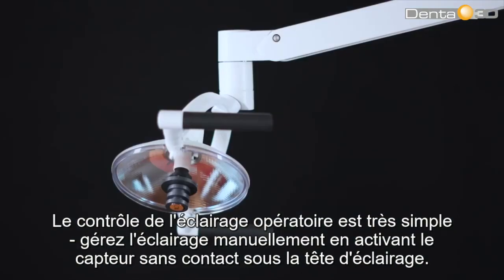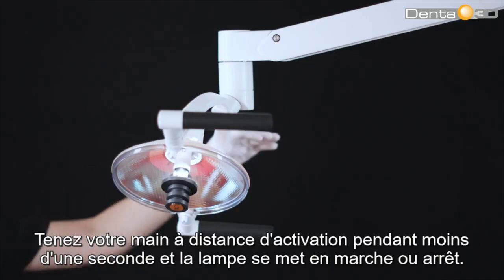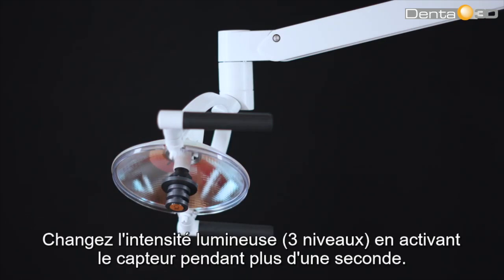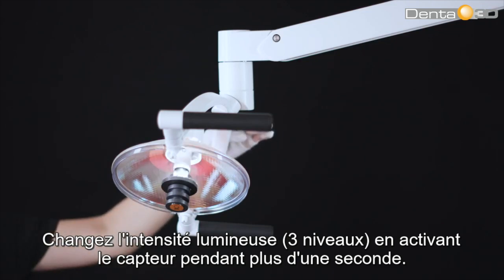Controlling the operating light is very easy. Manage the light manually by activating the no-touch sensor under the light head. Hold your hand within activation distance for less than one second and the lamp switches on and off. Change the light intensity — three levels — by activating the sensor for more than one second.